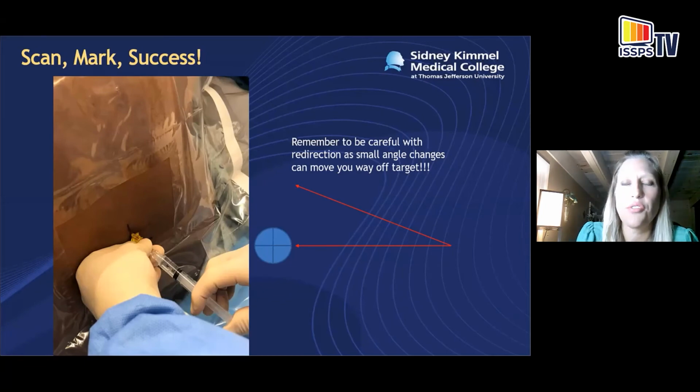But if you adjust your needle angle, even the slightest, you're going to be significantly off your desired target. So it's important to try to estimate the angle at which you're imaging when you're in that interspinous view, and it'll help give you an idea of the angle at which you should place your needle. But when you're doing neuraxial on the obese patient, just make sure you're very deliberate and careful with adjustments of your needle.